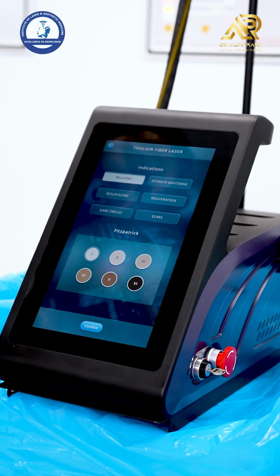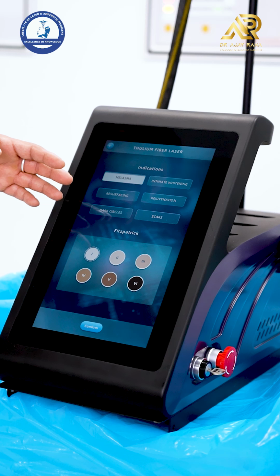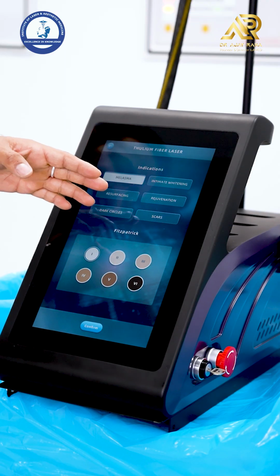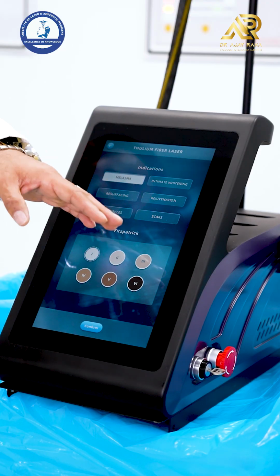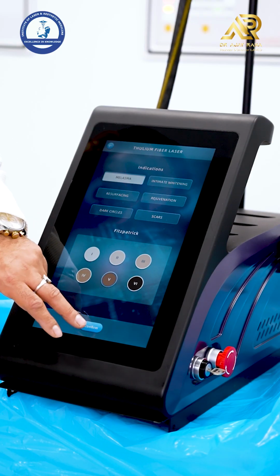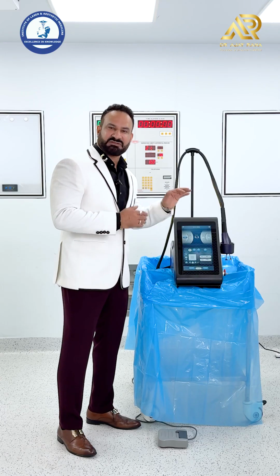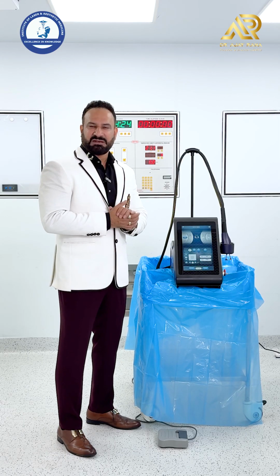In auto mode, you have different indications already mentioned here: melasma, resurfacing, dark circles, intimate whitening, which is genital lightening, as you know, rejuvenation, and scars. And then different Fitzpatrick skin types are mentioned here from 1 to 6. So let's say melasma, and you choose skin type 5, and then you confirm. What you see are the default parameters on the platform, from where you can start the procedure just by knowing the skin type and so on.